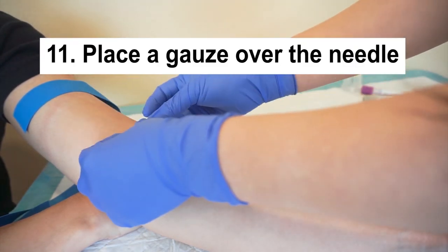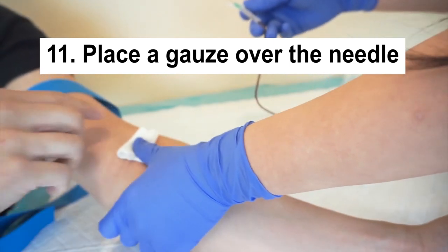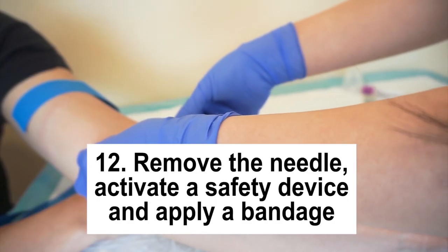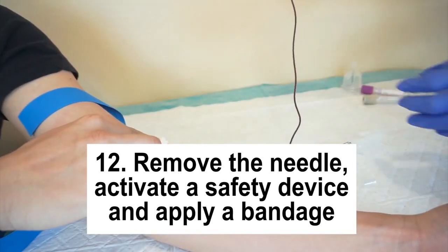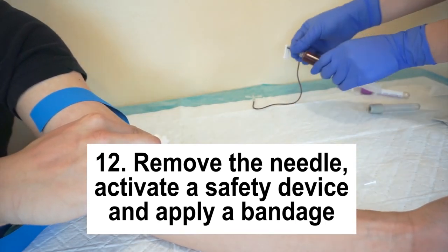Eleventh, place a gauze over the needle. Do not press down on the gauze because you will press on the needle that is still inside the patient's arm. You can also ask the patient to hold the gauze. I usually ask the patient to hold the gauze because that will reduce my risk of finger prick as I remove the needle from the patient's arm. Twelfth, remove the needle and activate the safety device immediately. Put a bandage on the patient, then ask the patient to keep pressure on the site for about 10 minutes.